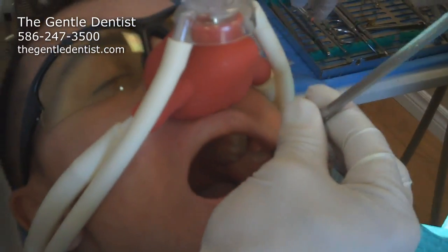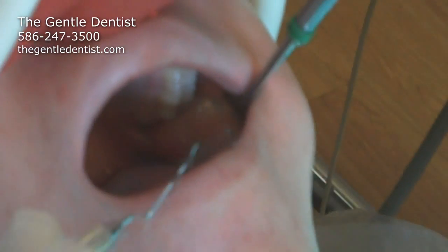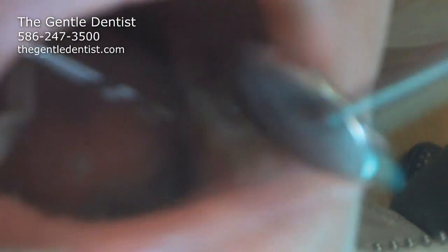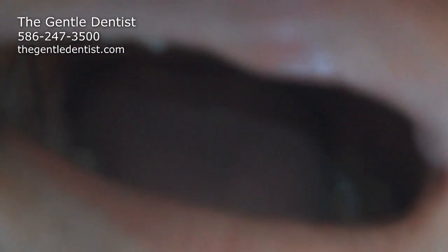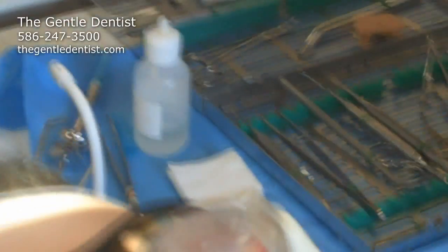If not, then right now Marshall is completely numbed up, and I want to point out where the teeth are going to be removed. These are his first molar, second molar, and the third molar is in this position right here. Actually, right in here I can feel his tooth. His tooth is just poking through the tissue. So we're going to make an incision here, reflect it back, and remove it. It's the same on his left side and also his right side, right back in here. So first thing we're going to do is numb him up.